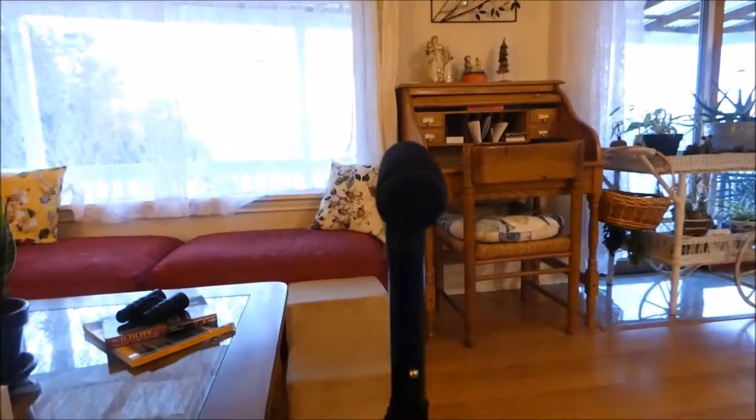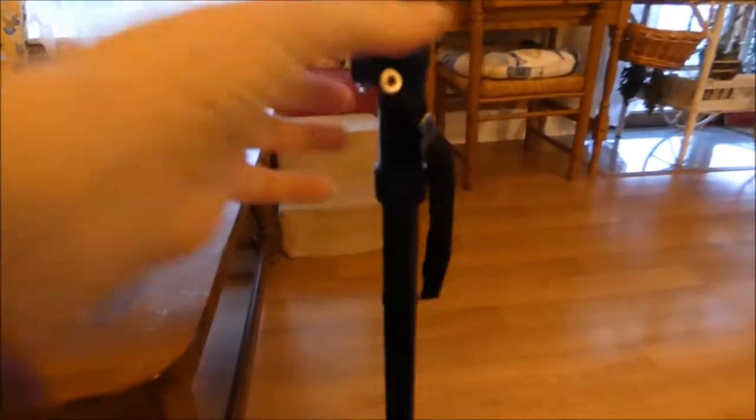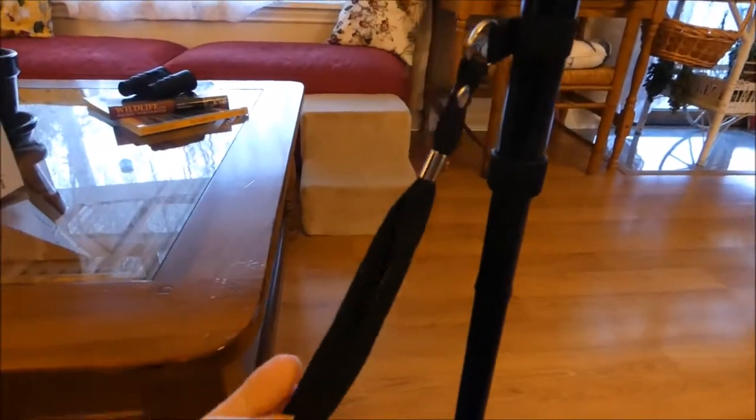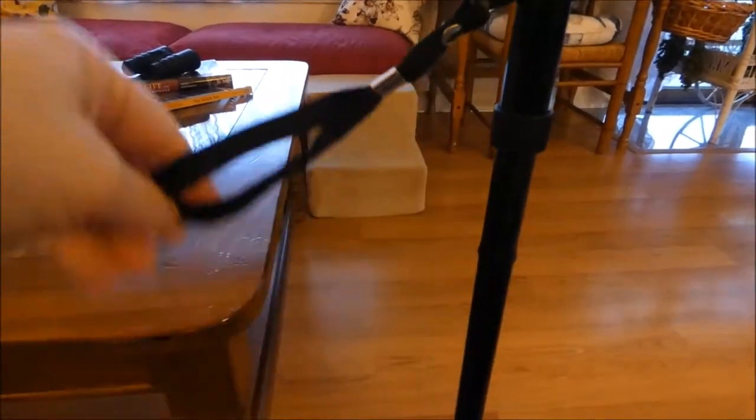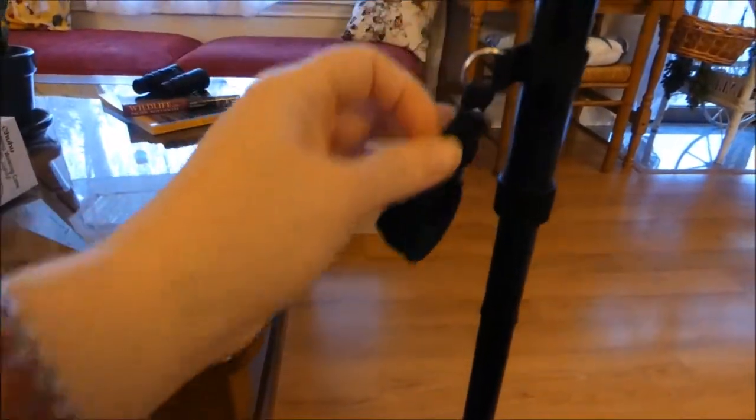It actually does stand on its own, which is nice. This is the little strap that wraps around when it's folded and snaps together to keep it folded.